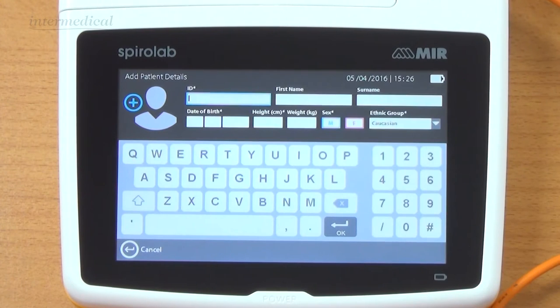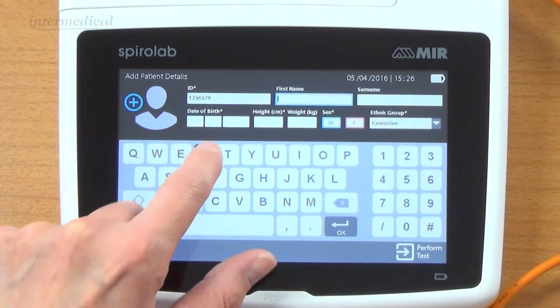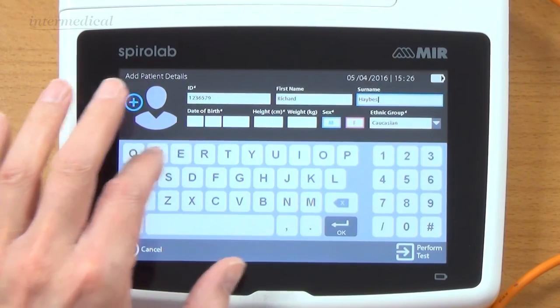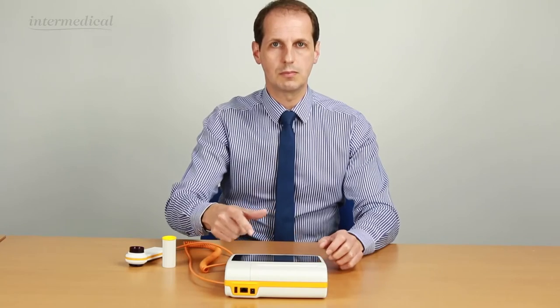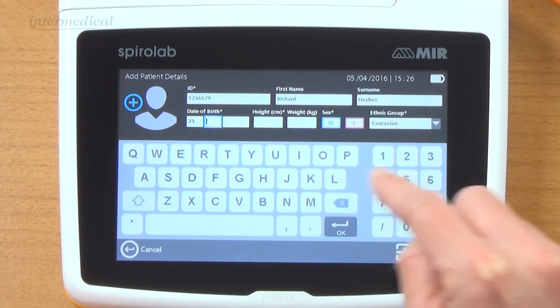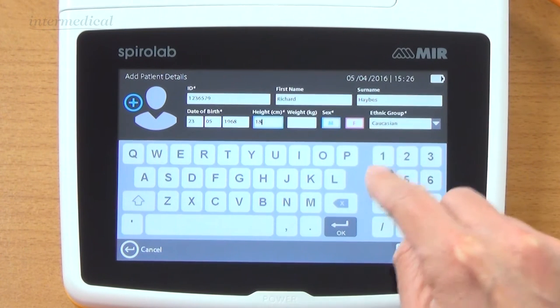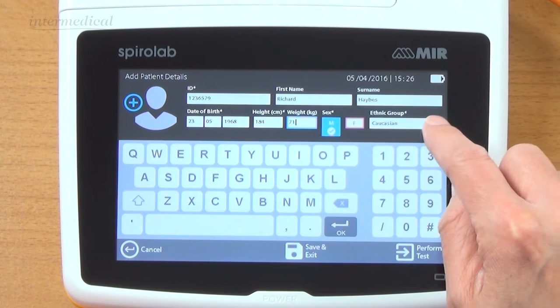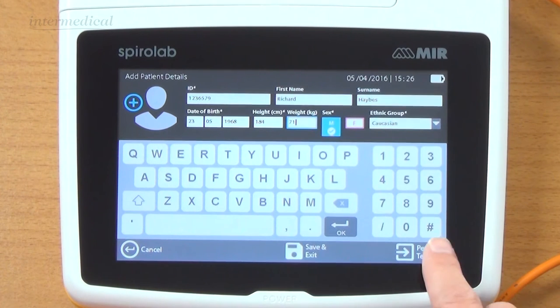I'm going to pop my details in - add new patient. The ID number, I'll just put in any number. First name, surname - you can see it's got a nice QWERTY keyboard on the screen. Pop my date of birth in, and it moves along through each box as you're entering details. Height in centimetres, weight, ethnicity, and male or female. These are the options. This is where you could save it or cancel it.